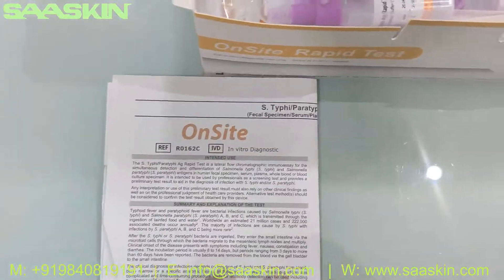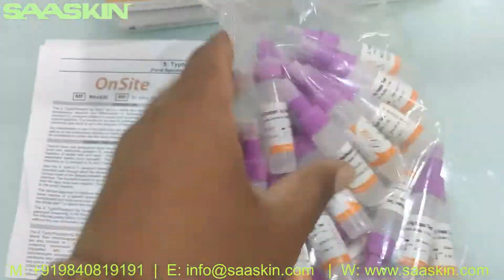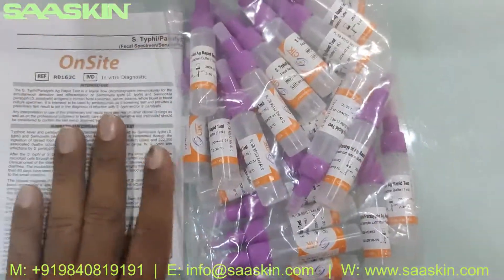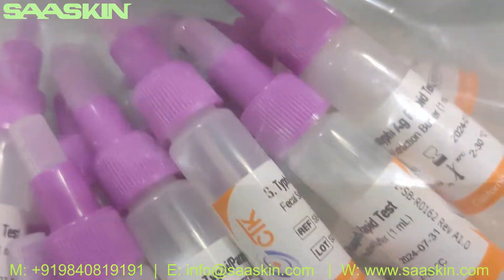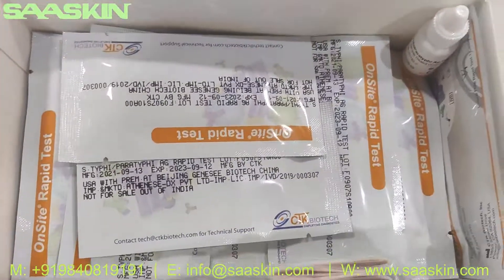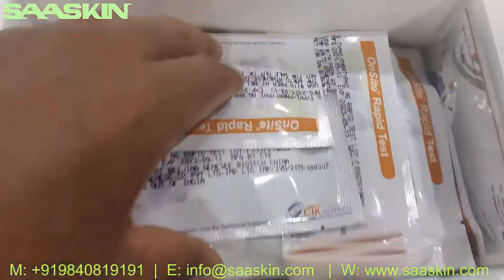Let me keep this here. Inside, if you see, you have the specimen collection device — you got 25 in the pack for specimen collection. You also got 25 plastic droppers here. Let me also show you the specimen collection bottle — how it looks like. This is the 25 in the pack, and inside you have the 25 test cassettes and one dilution buffer, 5 ml.